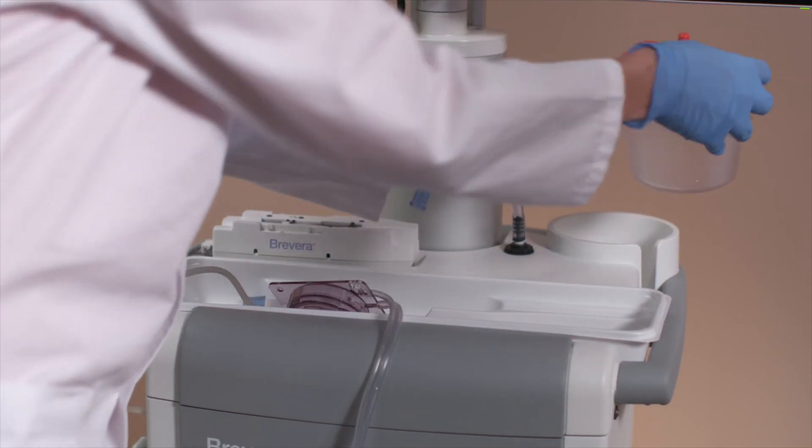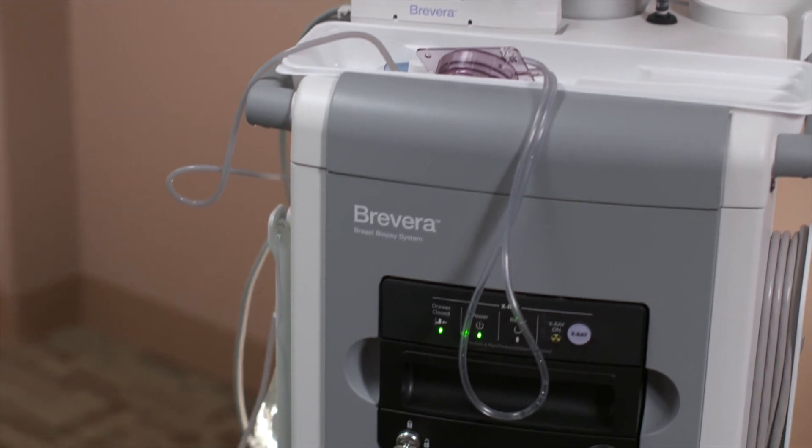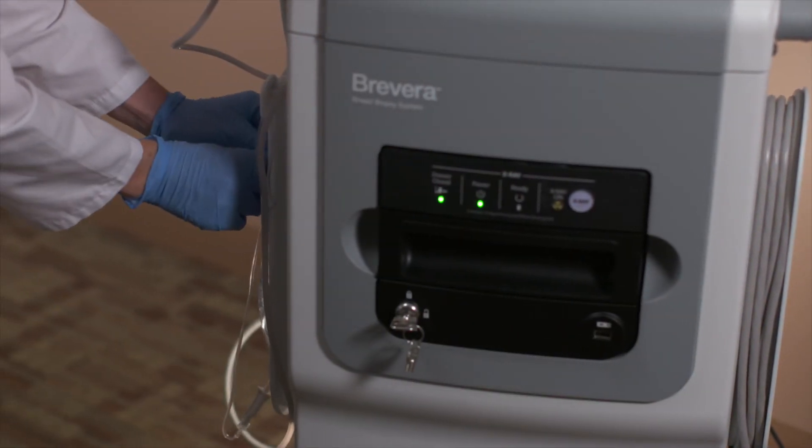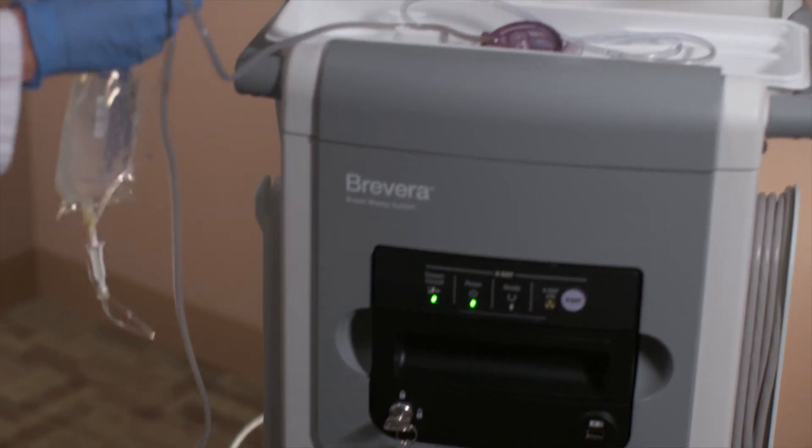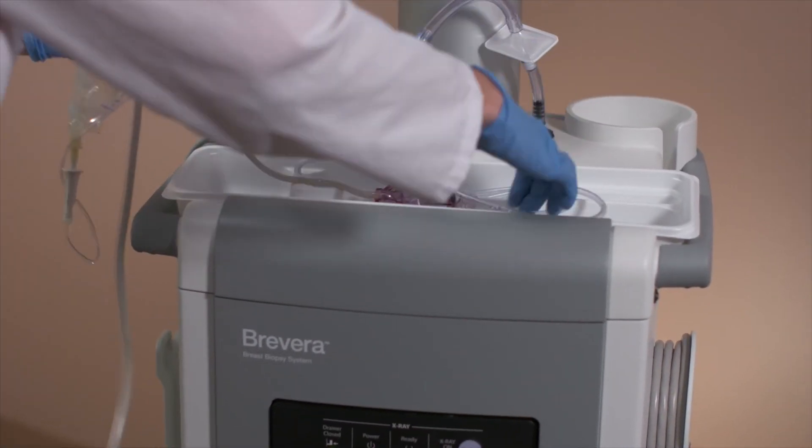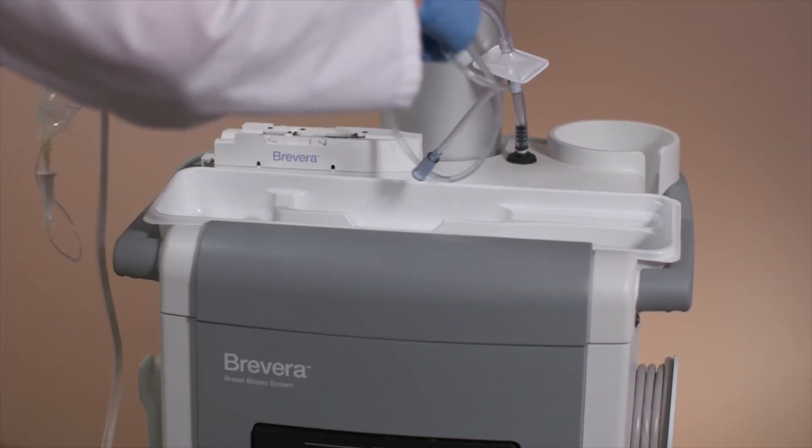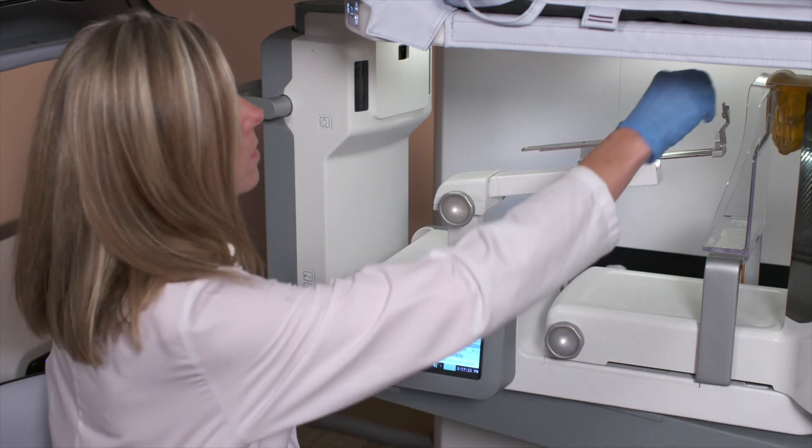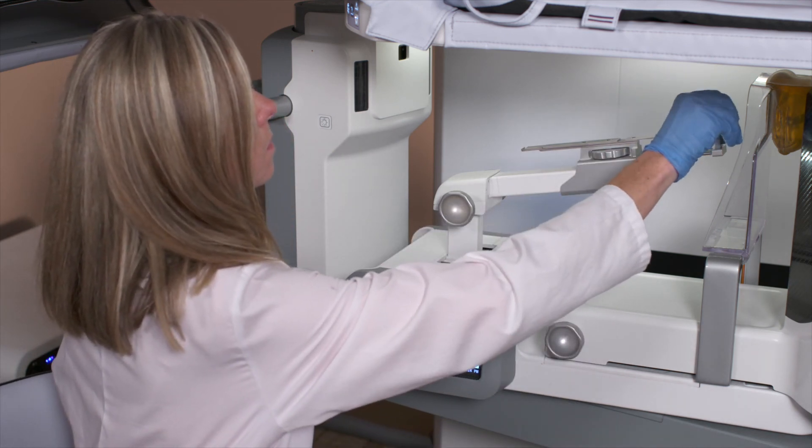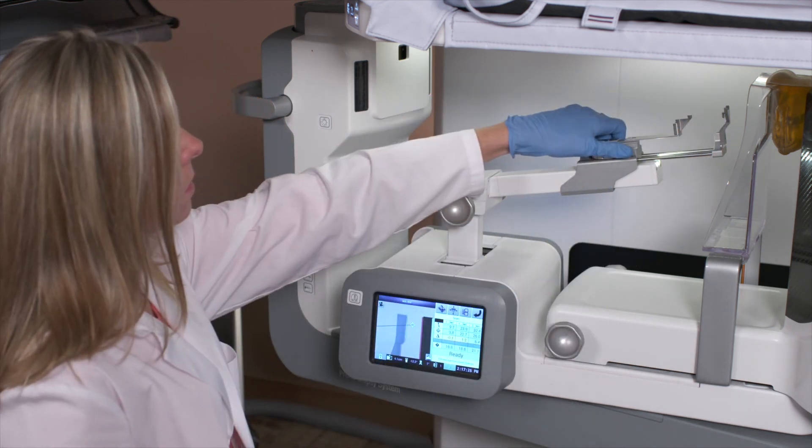The technologist will remove the silicone tubing section of the biopsy needle saline line from the pinch valve and remove the saline bag from the hook and dispose of all waste per the facility's protocol. On the Affirm prone biopsy system, the technologist will remove the needle guide and dispose of it per hospital guidelines.